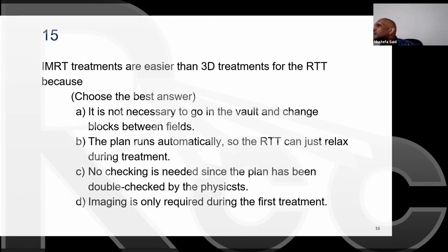But I want to talk about this since 27% answered B. The plan is automatic, so the RTT can just relax during treatment? That's a no, no matter how we progress in this field. Once you have the patient on the table, you're like on the battlefield. You've got to watch out, because the patient may move their arm while the gantry is moving.